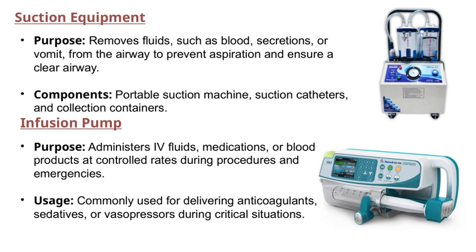For example, during critical situations, we often use infusion pumps to deliver anticoagulants to prevent clot formation, sedatives to calm anxious patients, or vasopressors to support blood pressure. These devices ensure that medications are given at the right rate and dose, which is essential for patient safety and effective treatment. Overall, both suction equipment and infusion pumps are fundamental tools in patient care, helping us maintain airway patency and deliver life-saving medications efficiently.